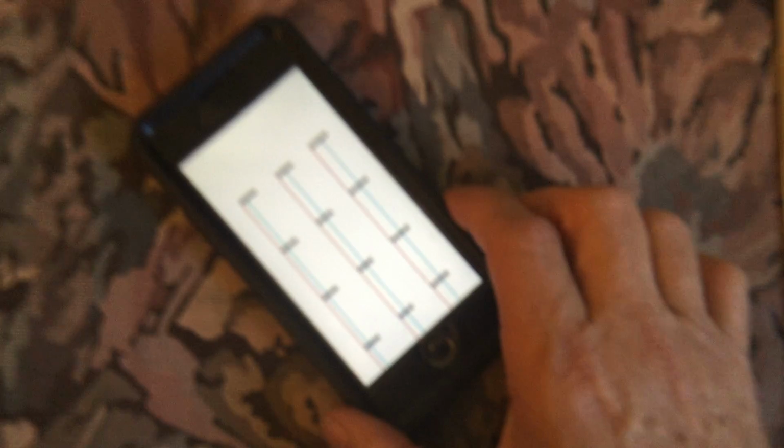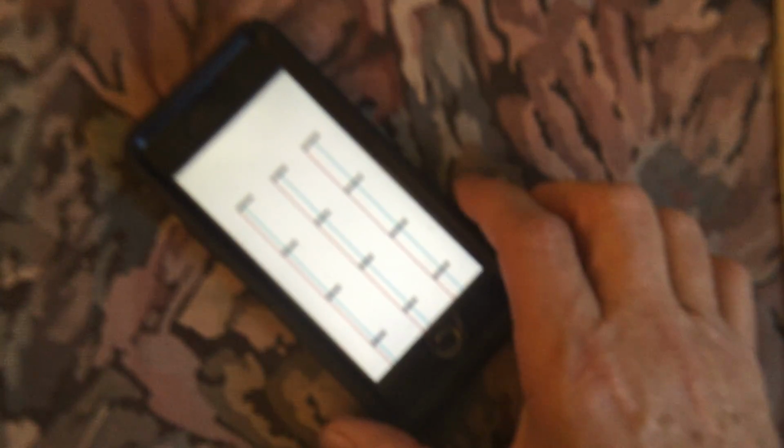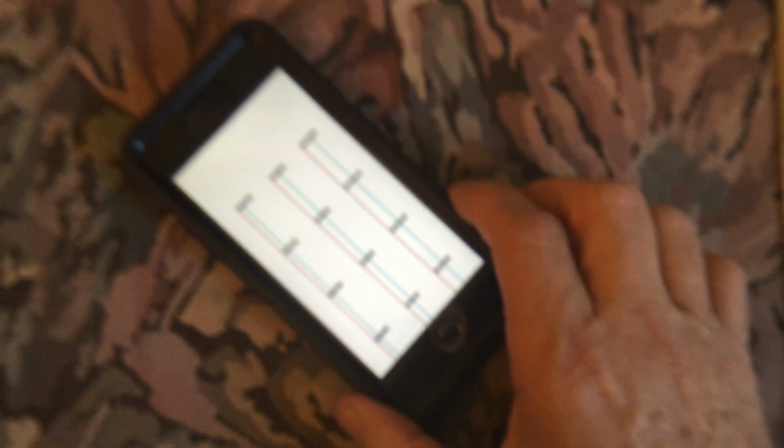Now at this point, we're going to initially start by rotating the phone slightly 10 to 15 degrees in one direction and noticing that the central white space is thinning in this direction as the blurs widen or increase. And then when moving this direction, actually the central white space appears to be widening or getting brighter. We're going to continue moving the phone in the direction that the central white space appears to be getting brighter.